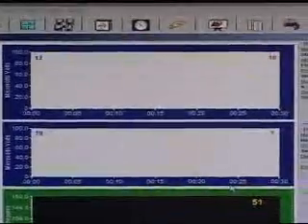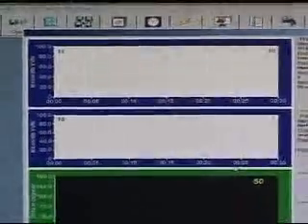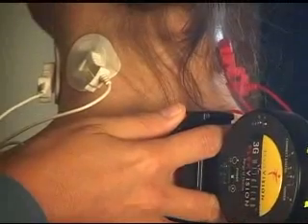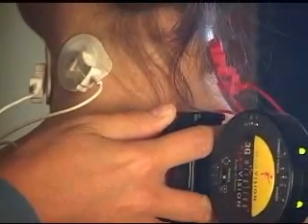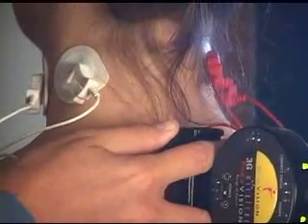We begin the test, and the bottom is the range of motion. The top half of the graph is the cervical paraspinals. The bottom half of the top half of the graph are the SCMs. So we begin by holding down the button. You press and release, and then you'll start the test. That's how you begin each of the tests, by pressing and releasing only one button, not both.